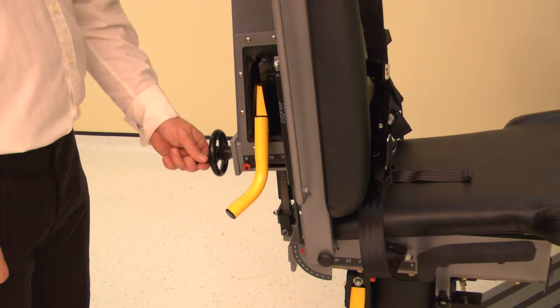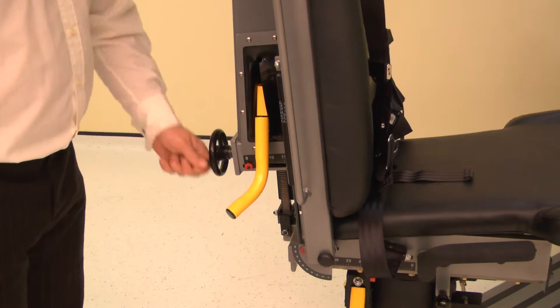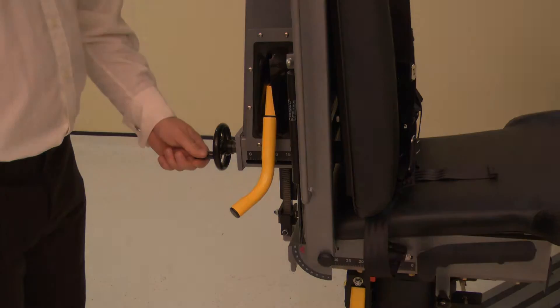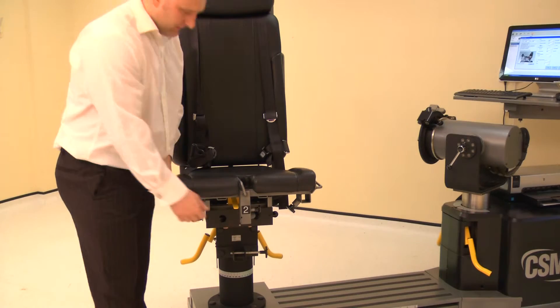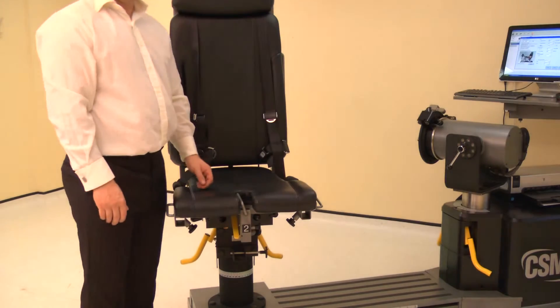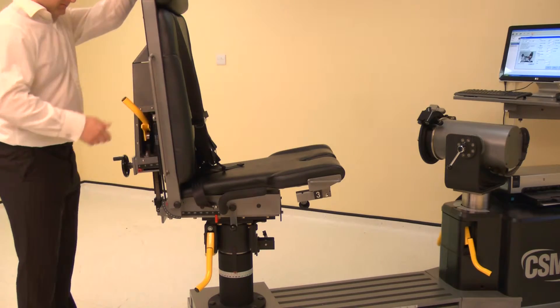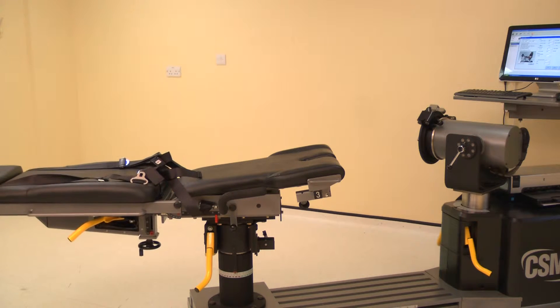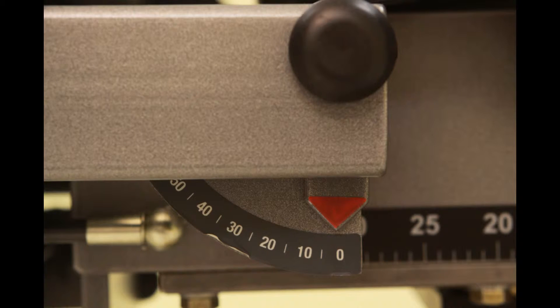Set the chair back translation by winding the handle. Adjust the chair back translation to position 0. Set the seat to the down position by lifting the seat and releasing the lock. To set the chair back angle, lift the locking handle and adjust the chair back to 0 degrees.